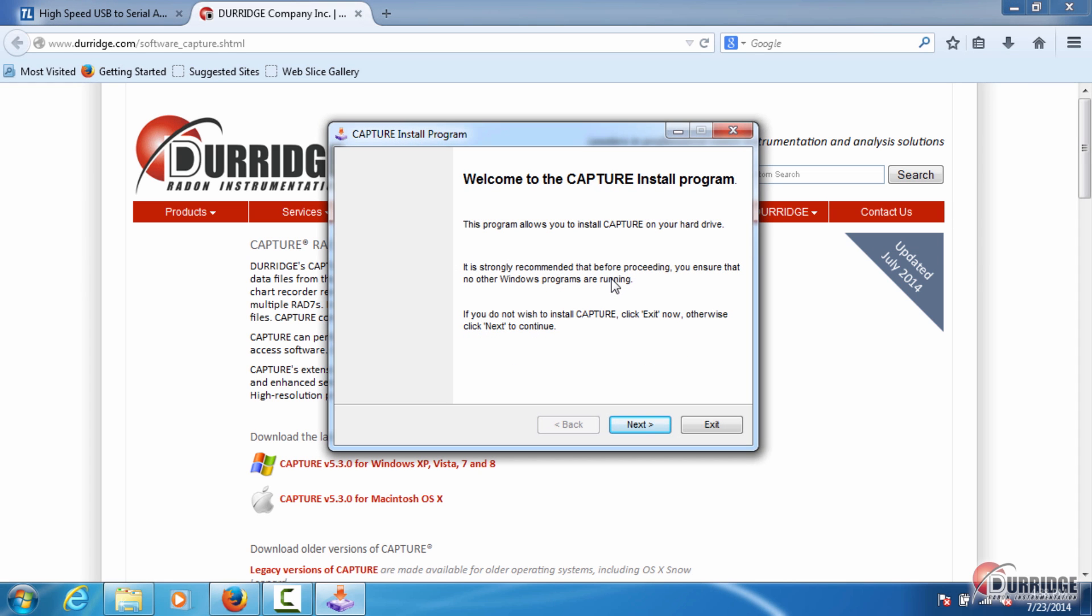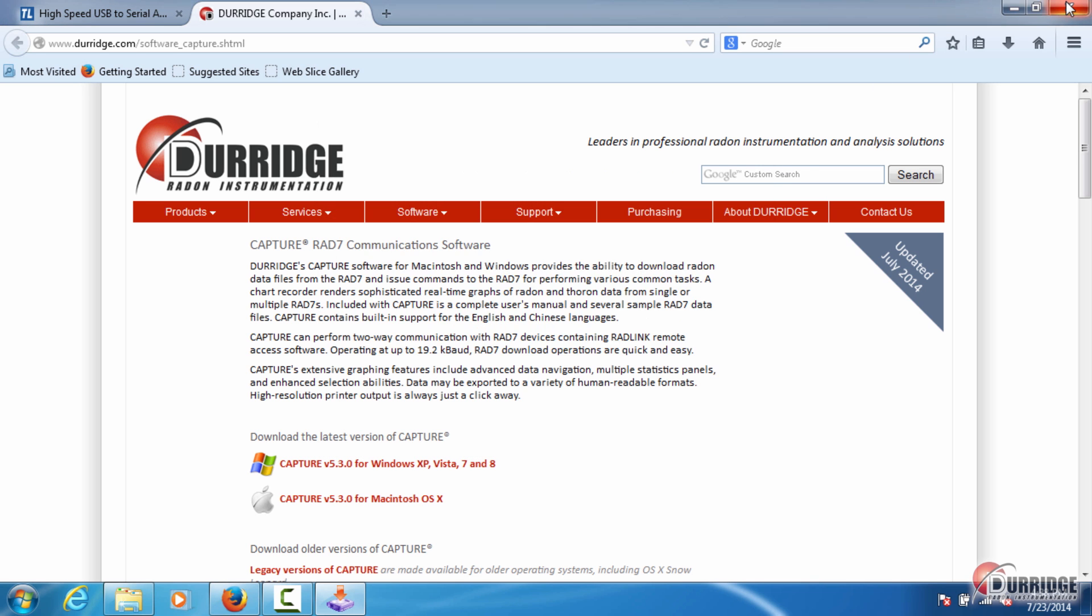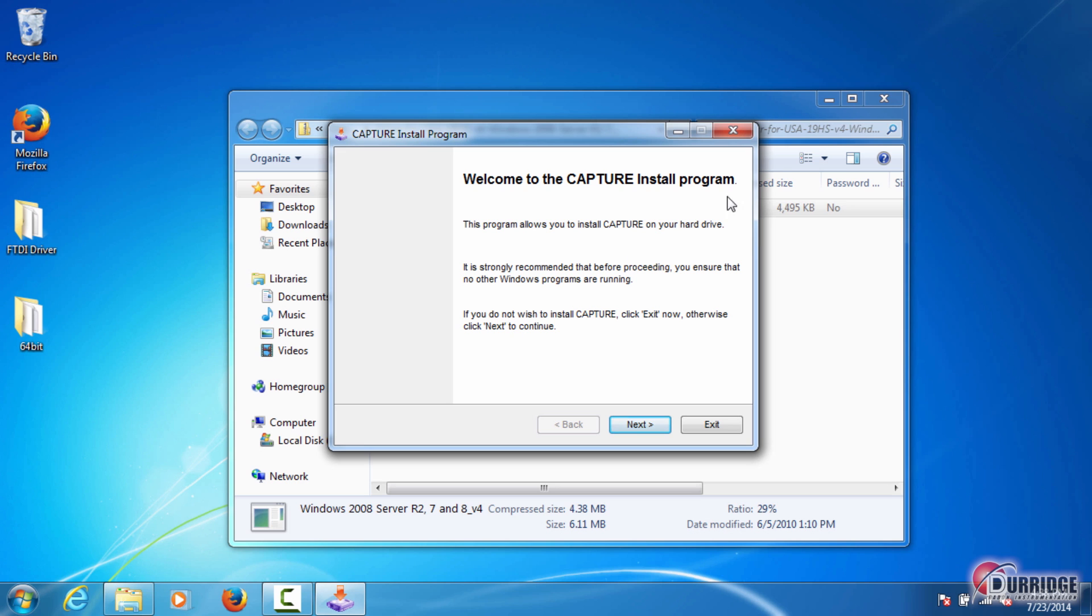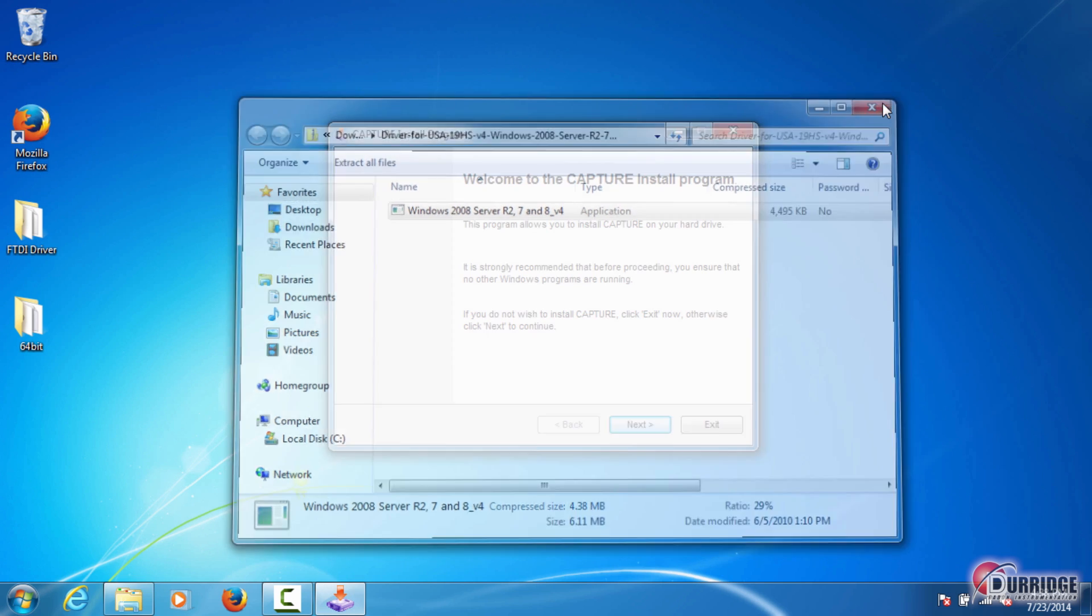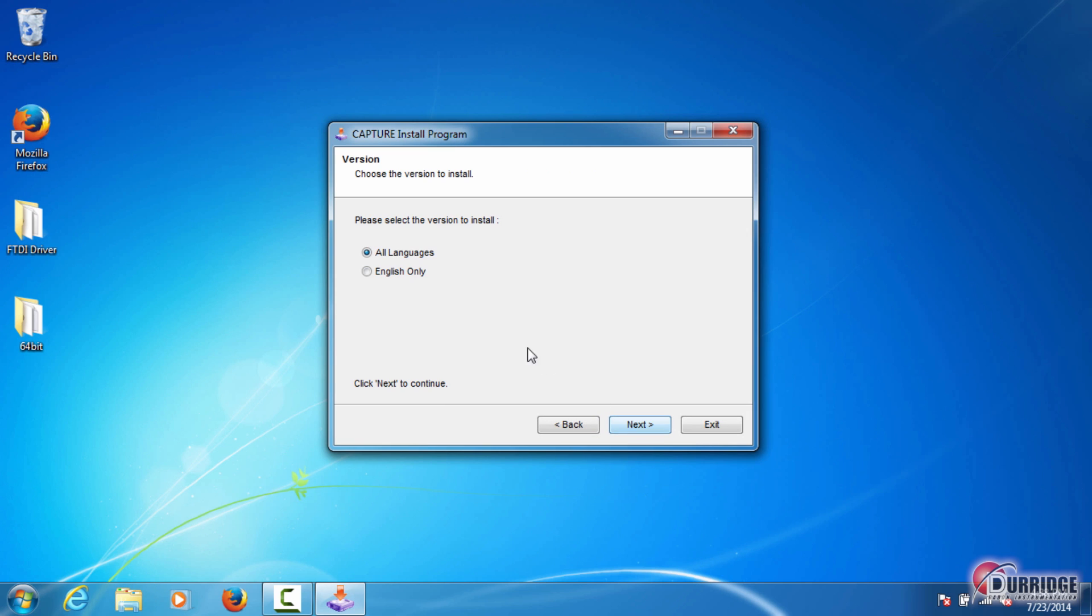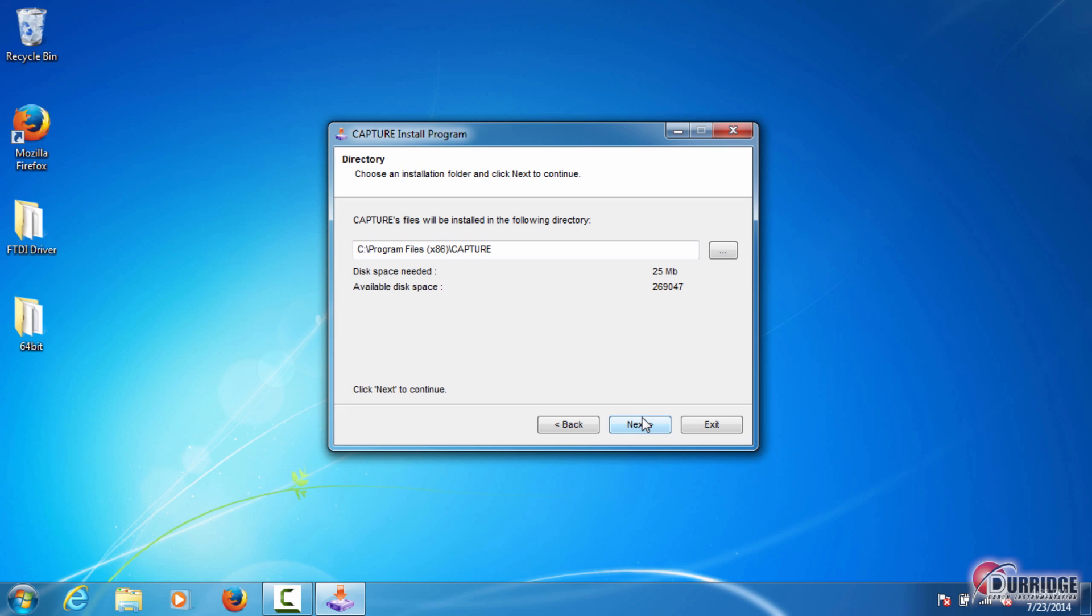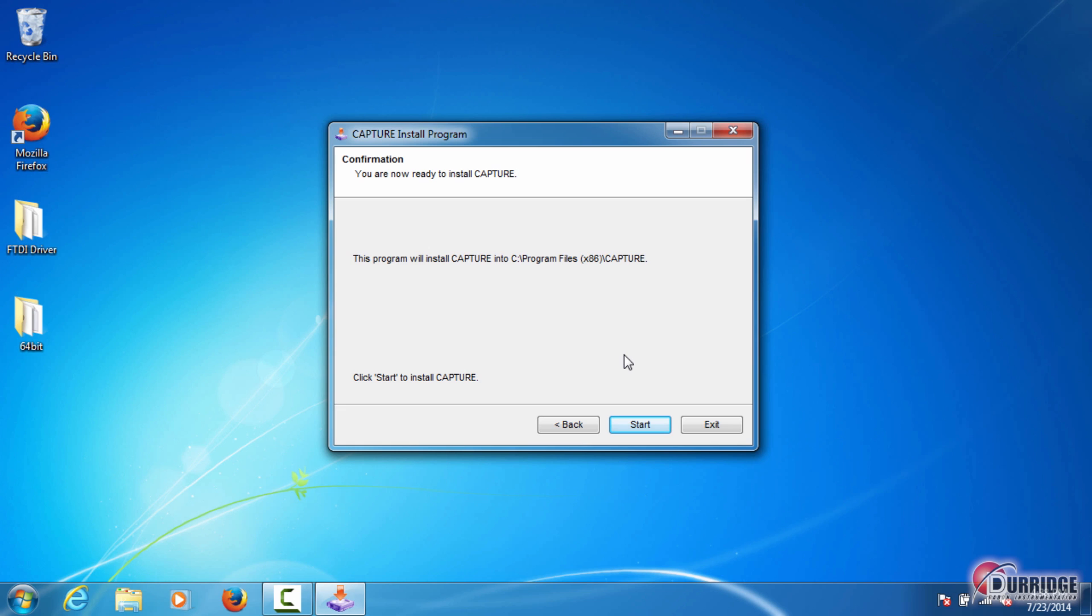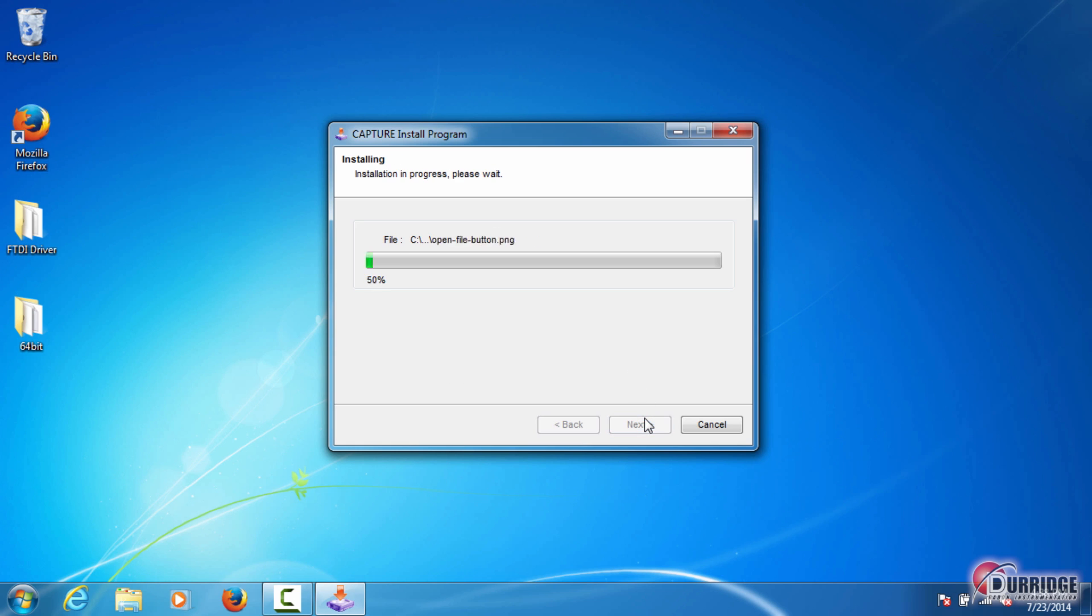As the Capture installer recommends, shut down the other programs you are running. Then click Next. Select version all languages or English only as you prefer, and click Next. Click Next in the directory window. Since the directory doesn't exist, you create it. It holds all Capture program files. Click Start to begin the installation.